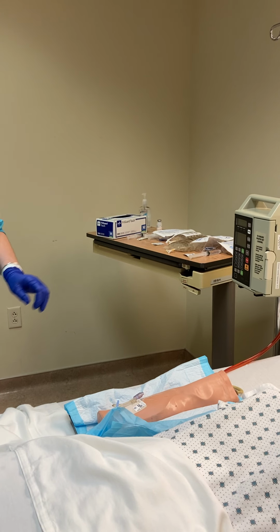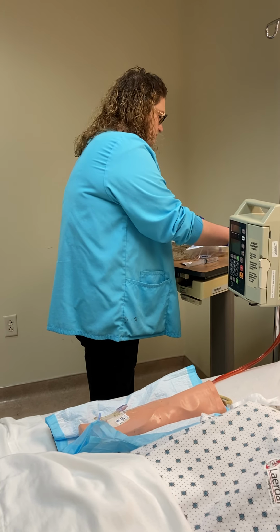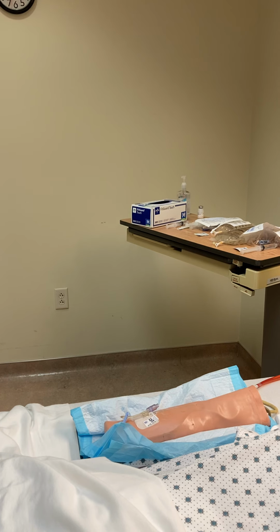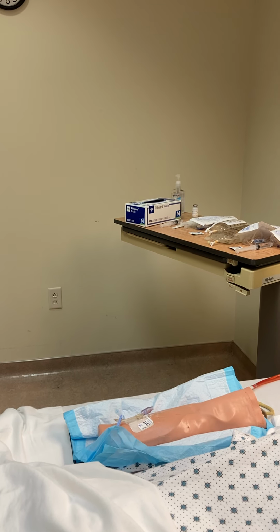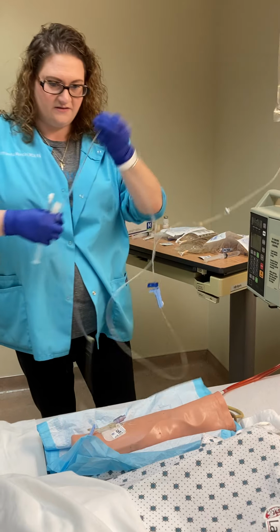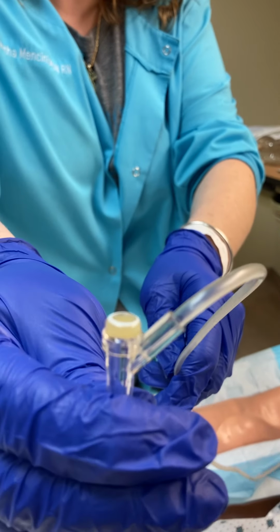Right. The other type of connector that you'll see is a simple connector.